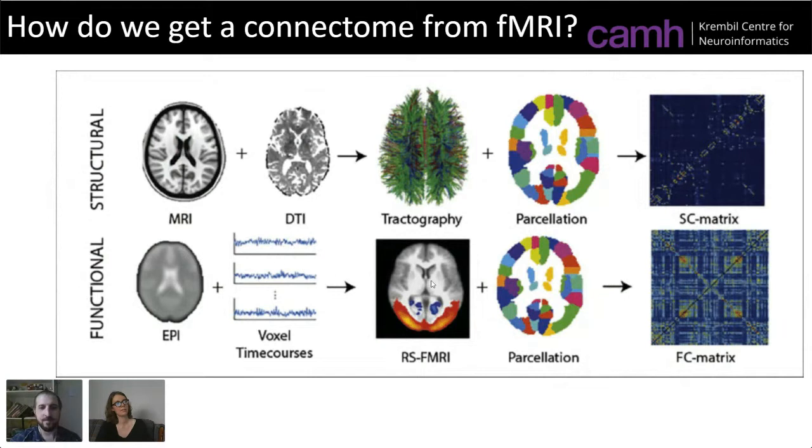If we correlate these things across brain regions, in this case, cut up the brain, average the squiggly lines across regions, and then just correlate all of those squiggly lines, we can get matrices. And those matrices have interesting properties, where parts of the brain that are actually quite far apart, say this one and this one, might be highly correlated with each other. And we might call those two parts of the brain parts of the same brain network.